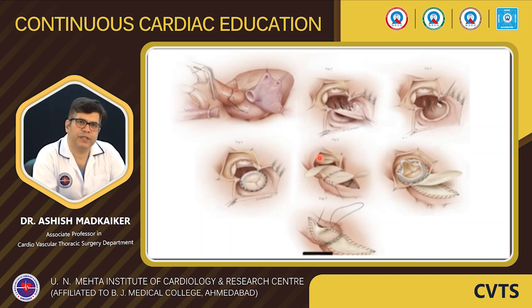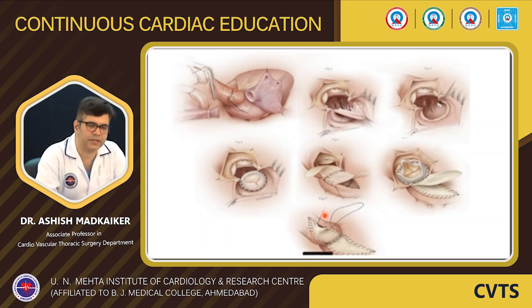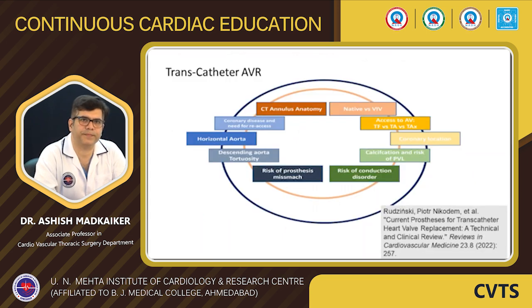So it is a procedure which is described to address the situation when we have double valve endocarditis, or in any situation when we lose the aortomitral curtain. And just to give an idea about this procedure, this illustration is used. It's a challenging surgery with high mortality and morbidity in the post-operative period.